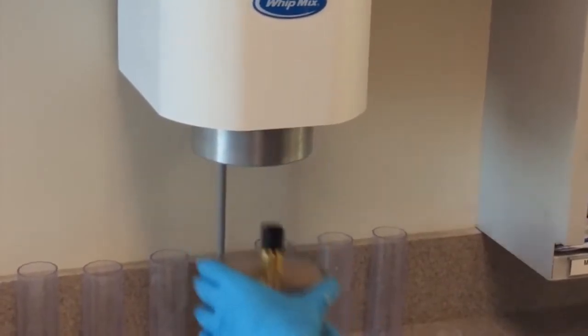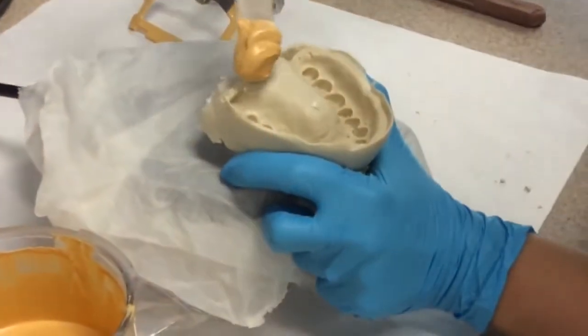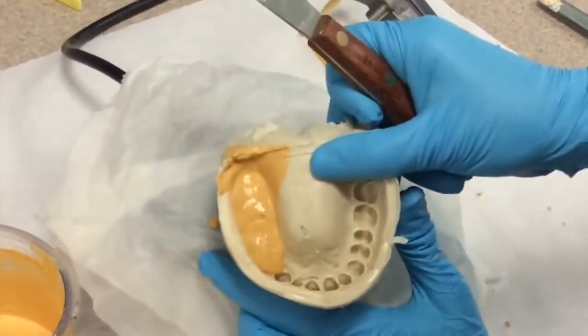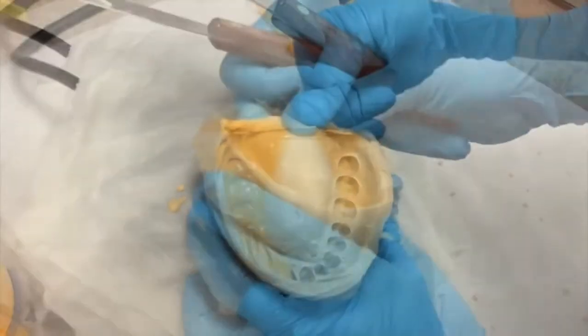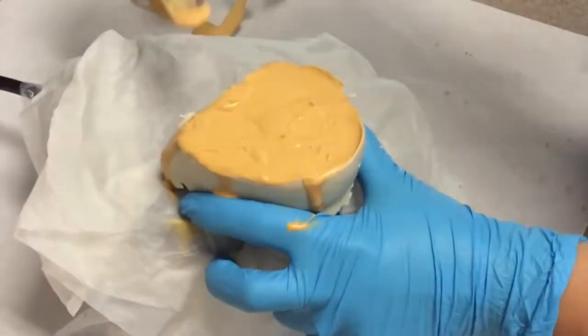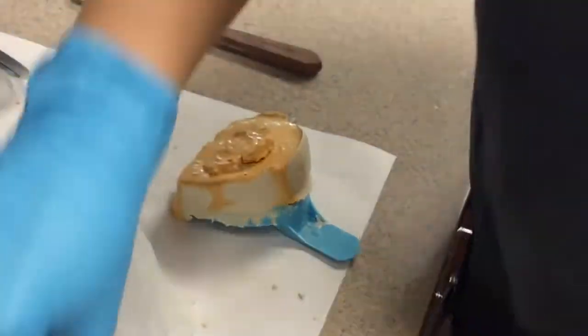Remove the bowl. Turn on the vibrating pad and place your impression on the pad. Add a little bit of stone to the back corner and allow it to flow through all of the teeth. You'll want to make sure there are no bubbles. If there are, you can pop them with your spatula and continue to vibrate it until there aren't any remaining. Once all the teeth are filled, you can continue adding stone. Keep adding stone until you've filled the full impression. Then you'll want to add some cones to the top of your cast — this will help the cast adhere to the base that you'll pour up later.